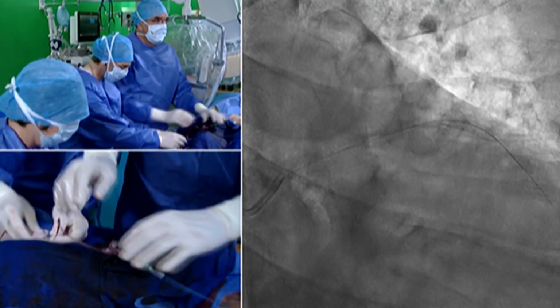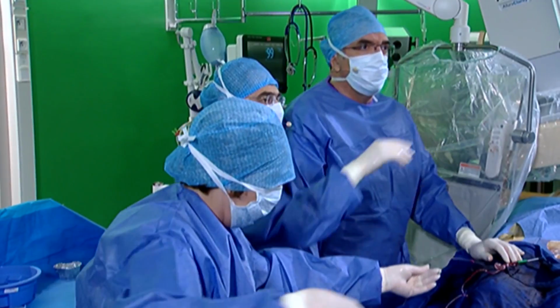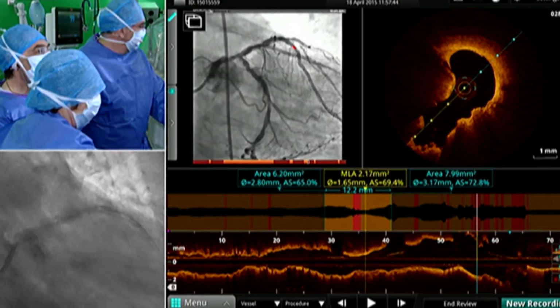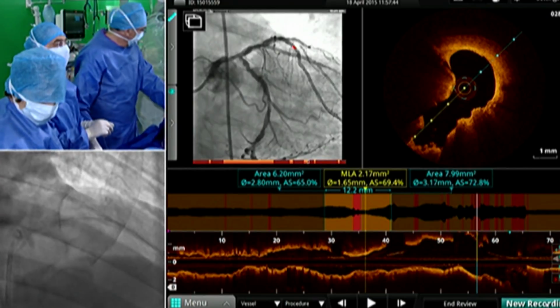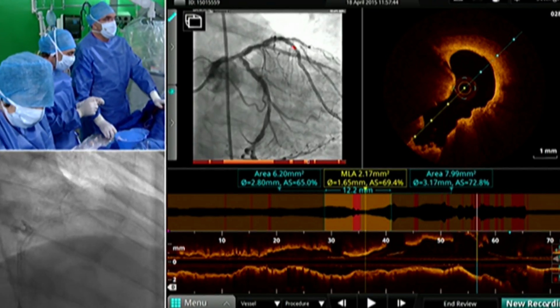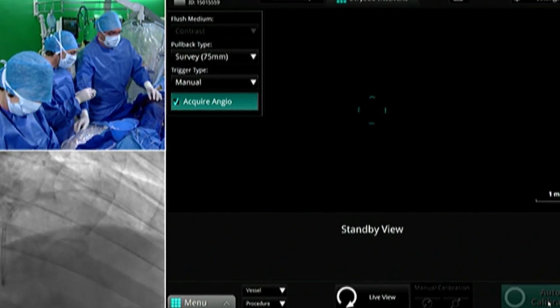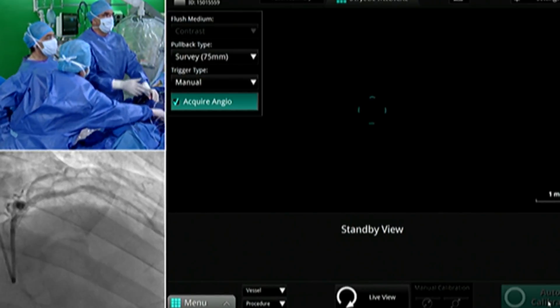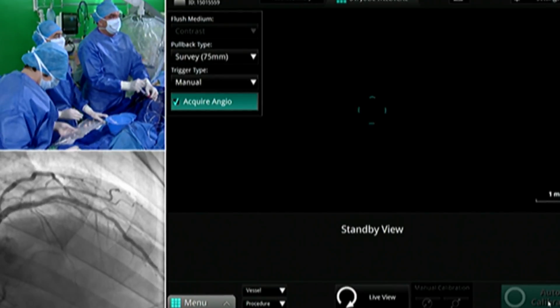That's good. Okay, so now OCT. We needed to have less overlapping of the view. And we were talking about how to select the angiography view for co-registration. You needed to select a view where you cannot have too many crossing branches through the main vessel, because otherwise your co-registration is going to be partially missed. So we are going to take this AP cranial view.